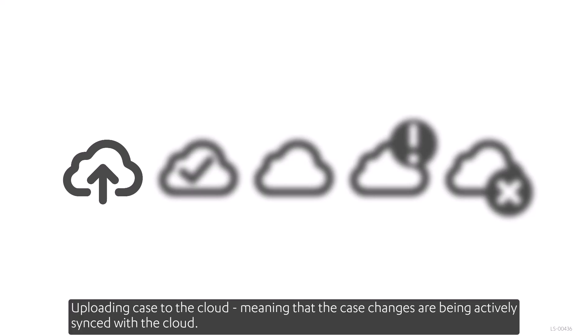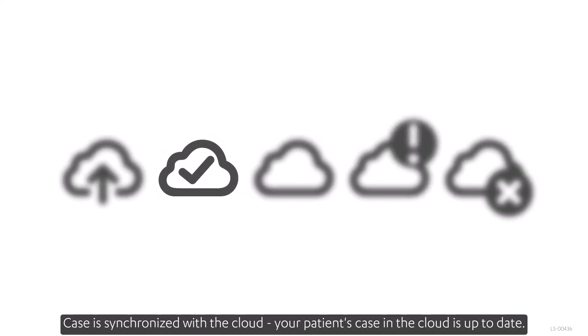Uploading case to the cloud, meaning that the case changes are being actively synced with the cloud. Case is synchronized with the cloud. Your patient's case in the cloud is up to date.